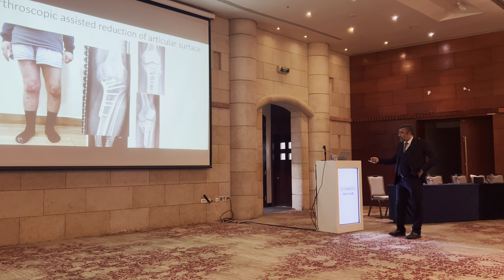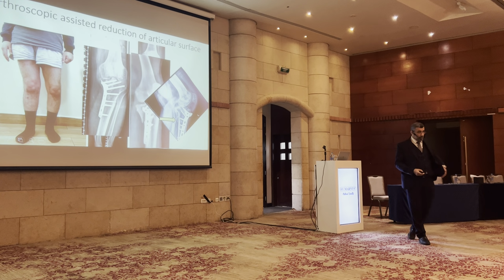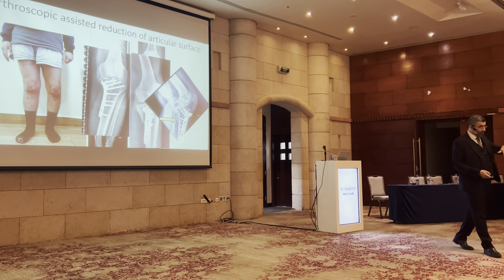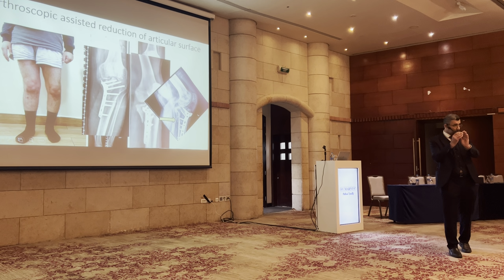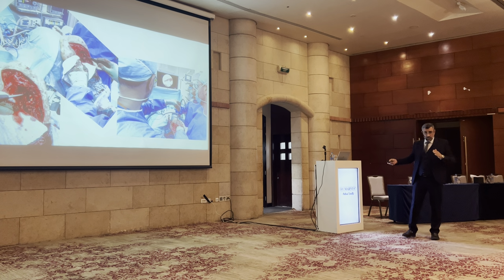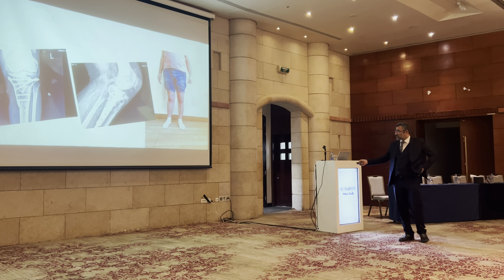So, what to do? The problem is it is healed. It is healed, you see here, and what to do? So you have to refracture it and then fix it. And the question is how to go through the articular part without progression of the osteotome or whatever in here. So what we did, arthroscopic assisted, progress the wire, follow the wire by chisel, and then reduction and fixation.